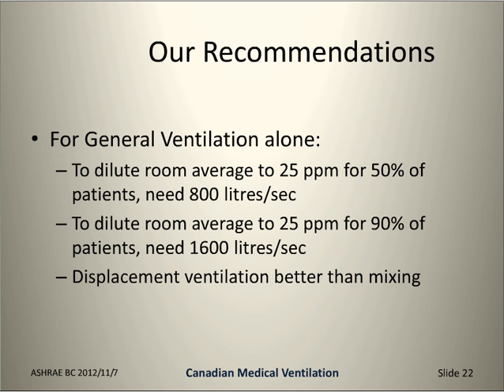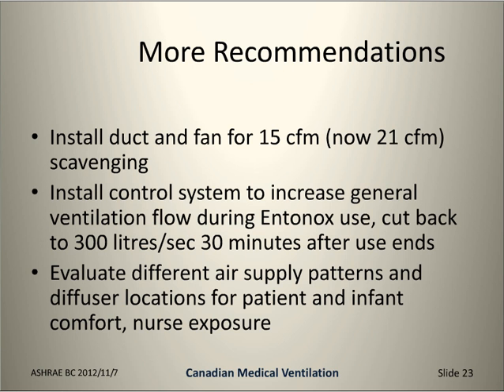There's a challenge with that, though. The nurses told me you can't have very much air motion over a newborn, because a breeze blowing across the newborn baby will cool him off too fast and cause a problem. And right after a child's born, they like to put it on the mom's chest for a couple of minutes, just because that's a good experience for the mom and the newborn, I guess. Haven't got any firsthand knowledge of that, but anyway. You've got to protect the baby from a draft in the same place where, a few seconds after, you want to provide a draft for the nurse. I haven't worked out yet how that would be done, but those were some ideas to toss out there, some challenges for people.